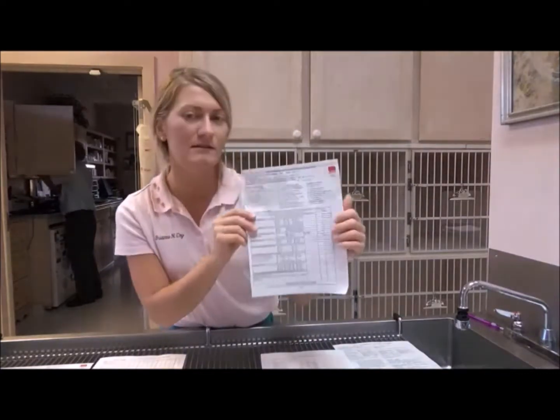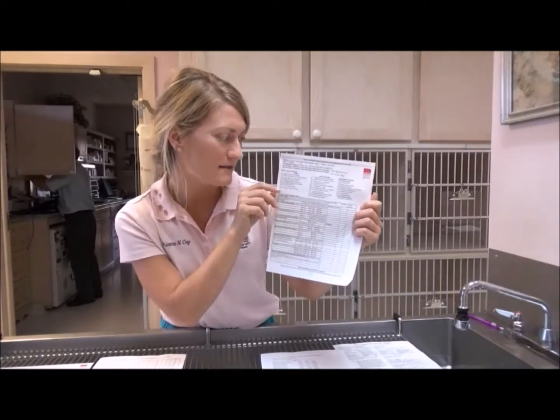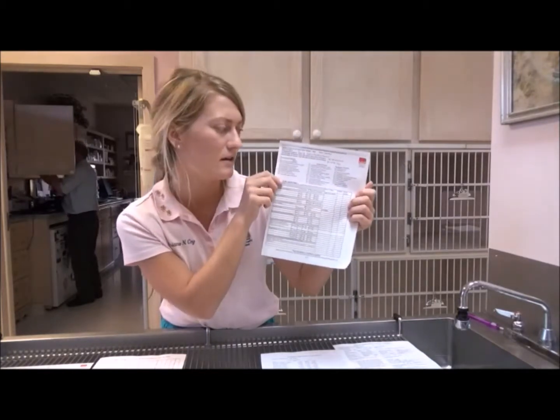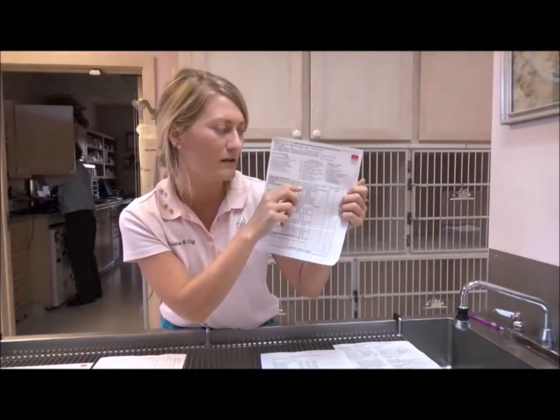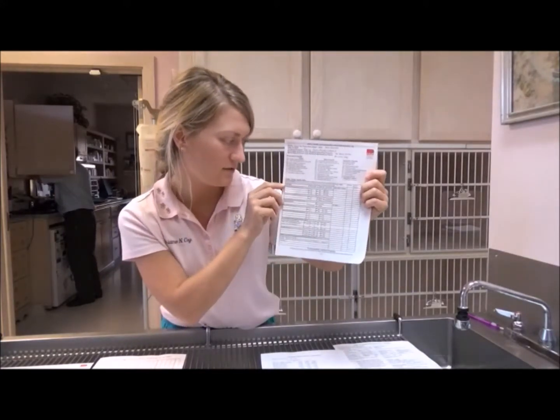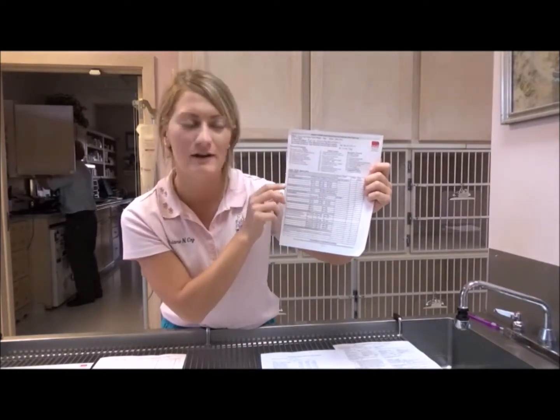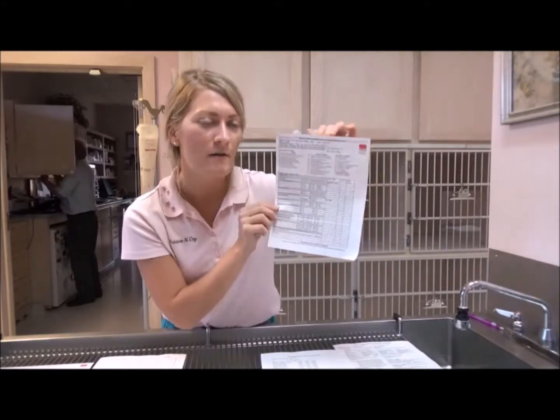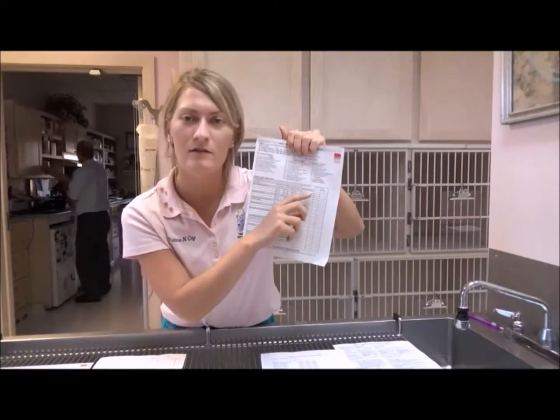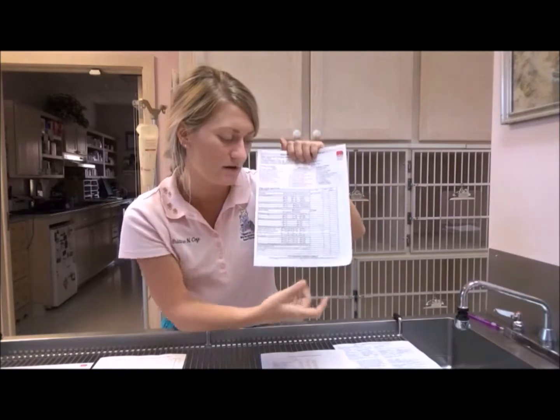The third form is our anesthetic monitoring and record log. On this, we have a lot of safety checklists. We have a pre-surgical checklist for the patient, a safety checklist, and then also an equipment checklist. This table here includes different drugs, fluids, anesthetic agents, and carrier gases, things like that used throughout the procedure. We just document the specifics of everything, such as the doses and rates given, the initials of who gave the item, and then the specific time on when it was given.